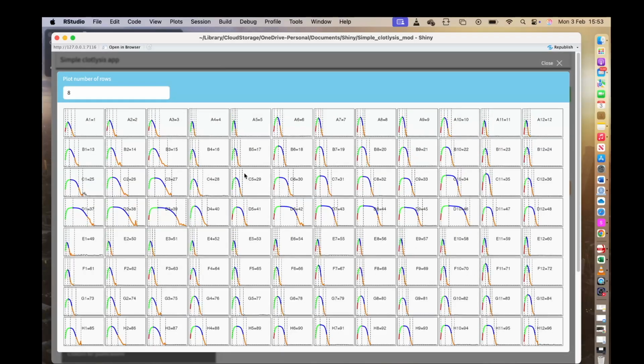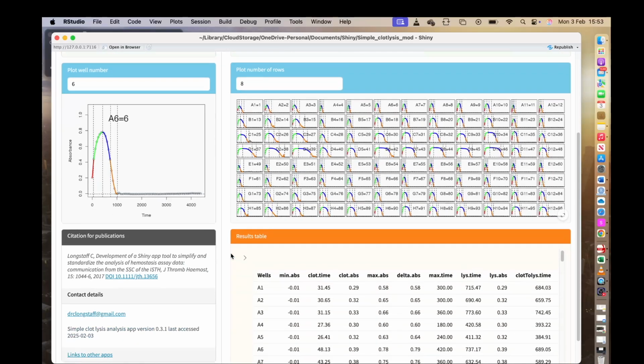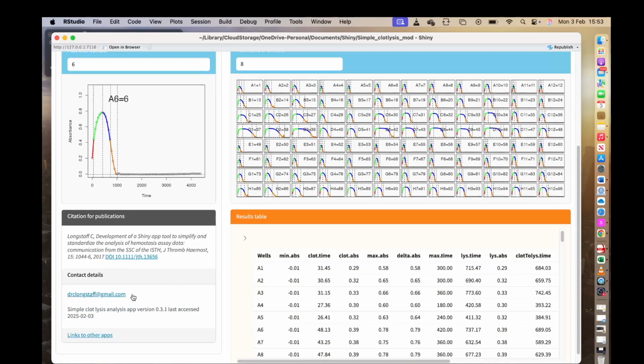If you have any problems or questions, my contact details are present in the app, and please do not hesitate to email me. It would be helpful if you provide the name and version number of the app you are using and, if possible, the data file that is causing problems. There is usually a simple solution and I try to respond quickly. Further details may be found in the comments section below. Good luck.